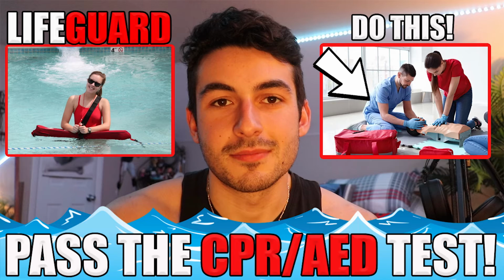Today I'm back with a brand new lifeguard video. In today's video, I'm gonna be talking about how to pass the CPR AED test at the end of the course. This is the test where your instructor is gonna bring you into a room, you're gonna have an infant, a child, and an adult dummy, and you're gonna have to do choking victims, CPR, use the AED, do rescue breathing, and all those things. So it's something that you have to pass in order to become a lifeguard.